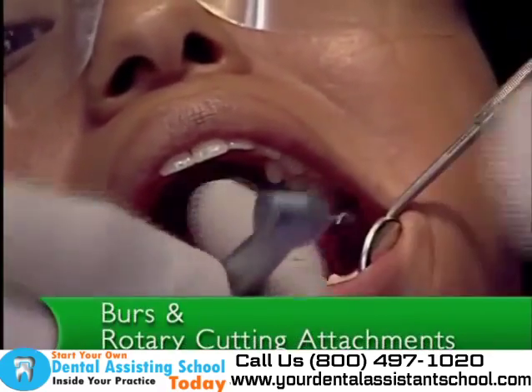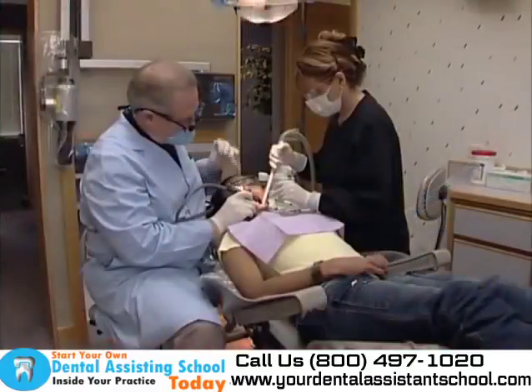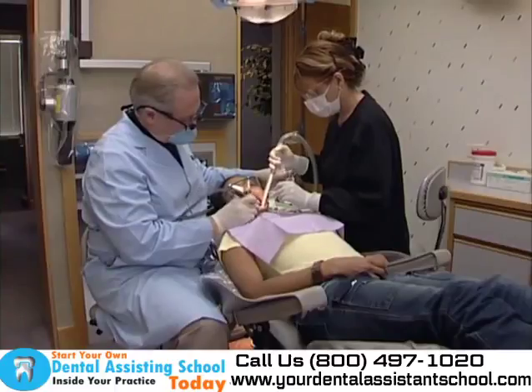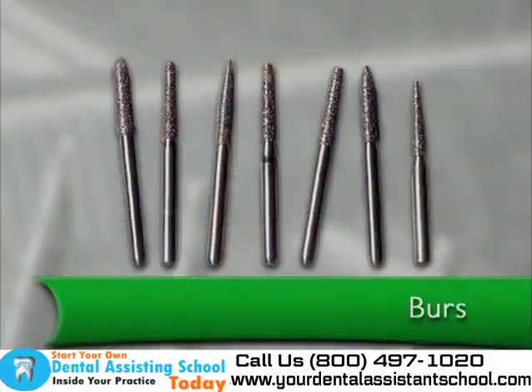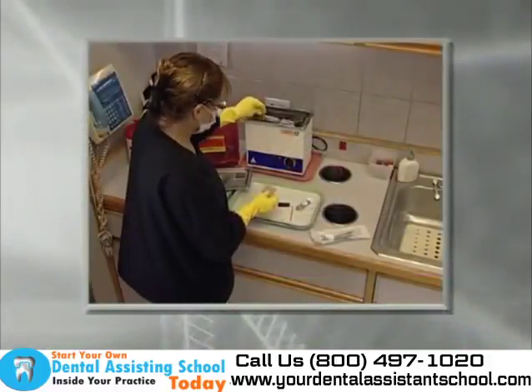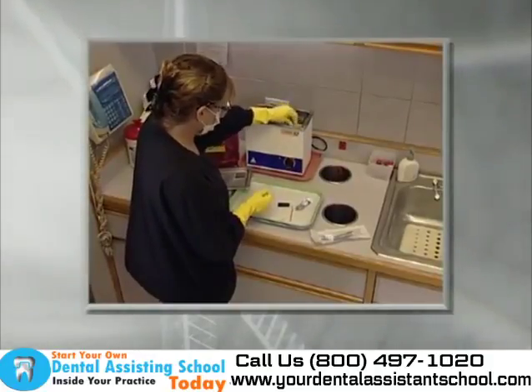Burrs and rotary cutting attachments connect to the handpiece. Burrs have many purposes that range from cutting to finishing to smoothing a tooth. Preparation burrs are used to cut the tooth surface. Finishing burrs are used to polish and trim the restorative materials. Burrs and rotary cutting attachments used intraorally must be sterilized between patients.